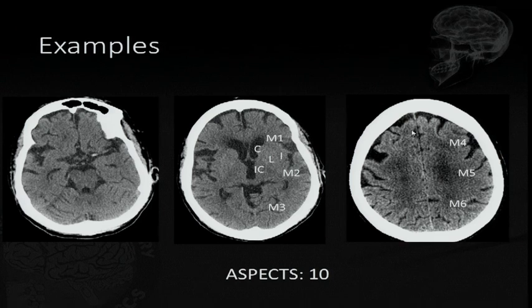And this patient mostly had an ASPECTS of 10. Maybe if you say there's an insular ribbon there, a loss of the gray-white matter differentiation, you want to give it a 9, that's fine. 9, 10-ish is fine because it's not going to make a lot of difference, so don't get caught up in the 9 and 8 or 10. So that's just an idea.